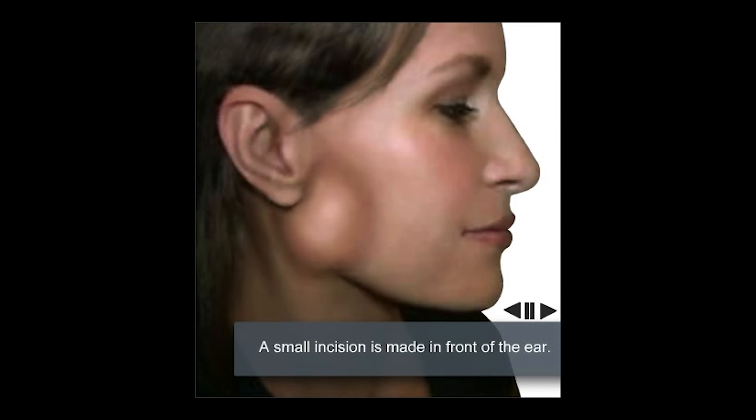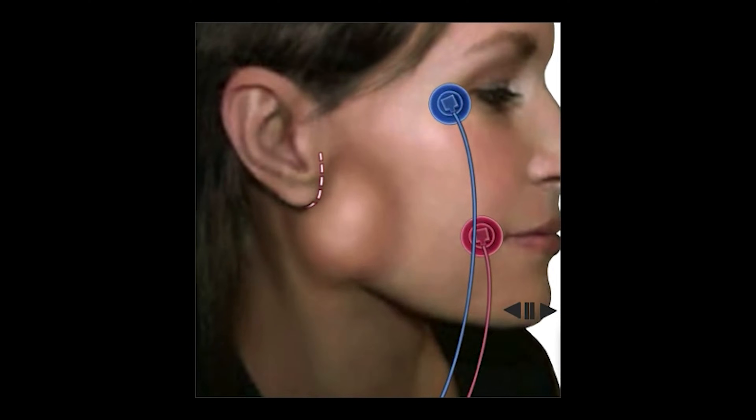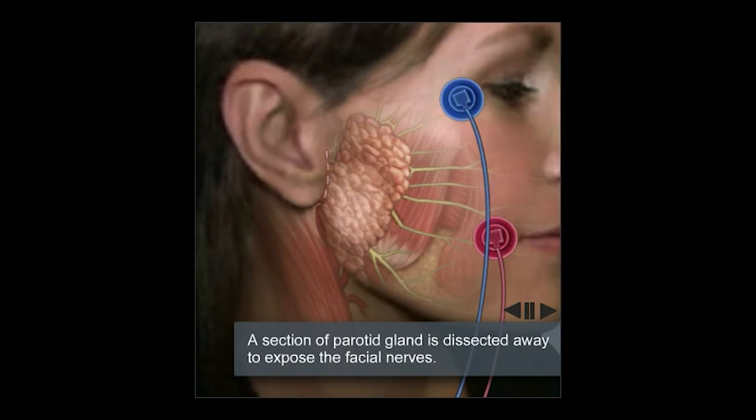At the beginning, we're going to make a small incision in front of the ear. Prior to this, we'll place electrodes — depicted by the blue and red discs on the face — which will monitor the facial nerve function throughout the surgery.